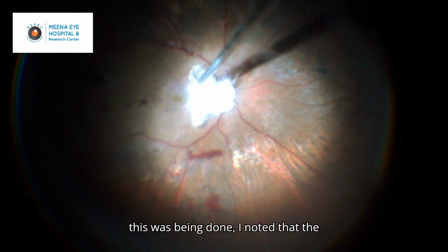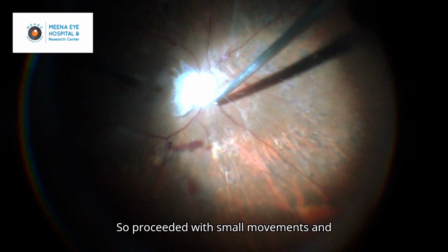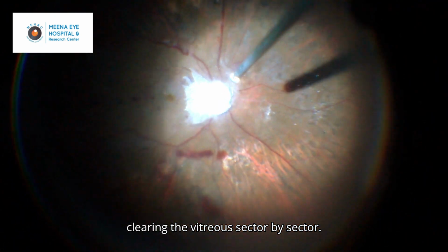But as this was being done, I noted that the macula was being lifted along with the hyaloid, and I didn't want any de-roofing. So I proceeded with small movements, inducing the PVD just around the disc and clearing the vitreous sector by sector.